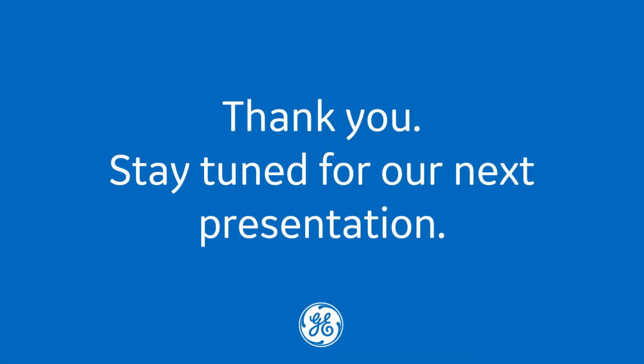Thank you for sharing your experience with us, Professor Knuuti. To recap, you shared 3 important takeaways with us. First, you shared that PET is one of the best imaging methods for detection of coronary artery disease. Second, quantitation has a major impact on detection accuracy and severity assessment. And third, the better count rates of digital systems suggest benefits over analog systems.